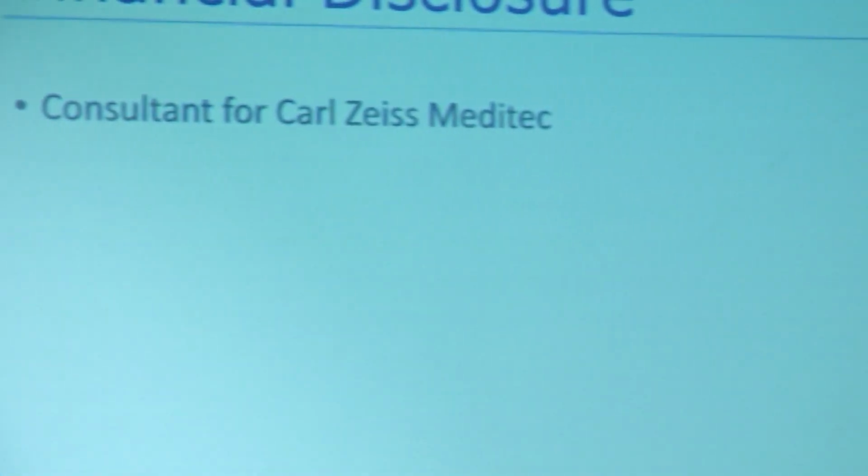So today we'll just discuss something that's not very clinical, but a little paraclinical, which is cataract workflow. As cataract surgeons, every patient who's coming in for surgery, we have to work them up. There's a process that they have to go through. Some of us who do more surgeries, this is something very relevant. So let's just discuss what all technologies we have available today.